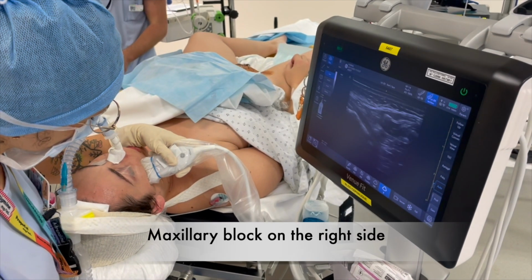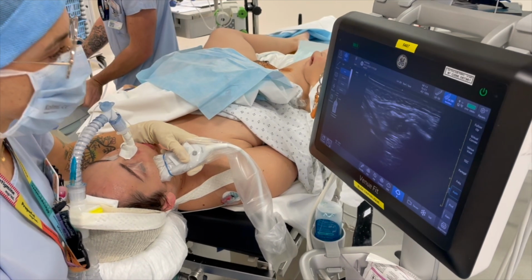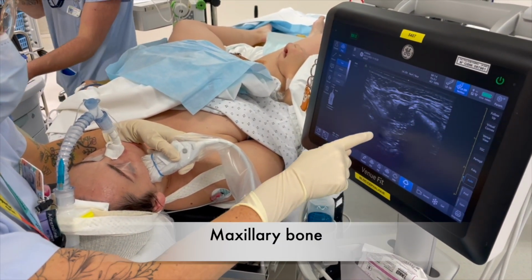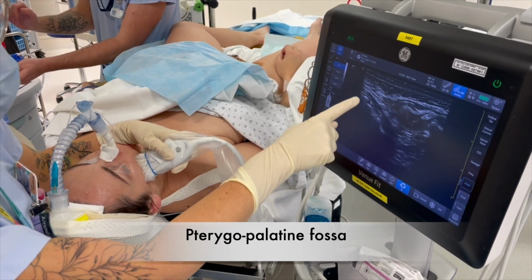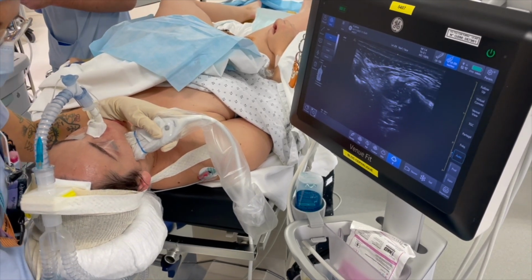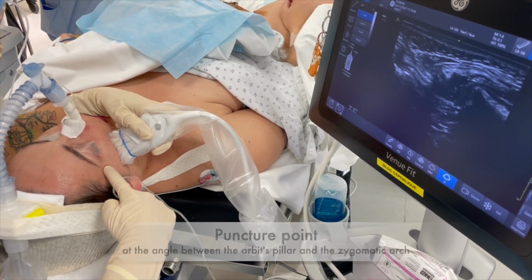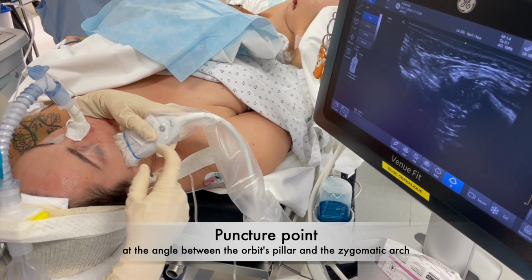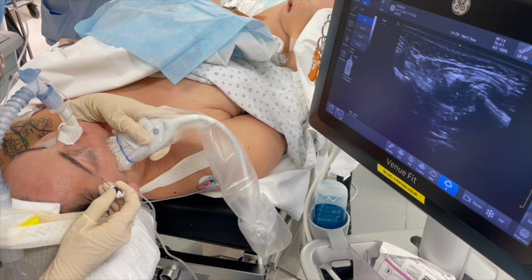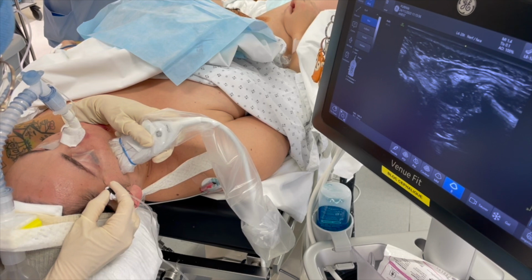The same procedure is then repeated on the patient's right side. The landmarks, the ascending branch of the mandible, maxillary bone, and the pterygopalatine fossa are identified. And the puncture point between the pillar of the orbit and the zygomatic arch is targeted. The needle is directed towards the orbit for 1 cm before reorientation towards the base of the nose.